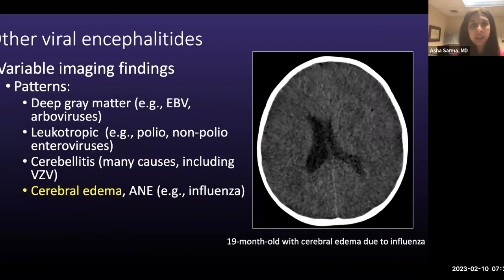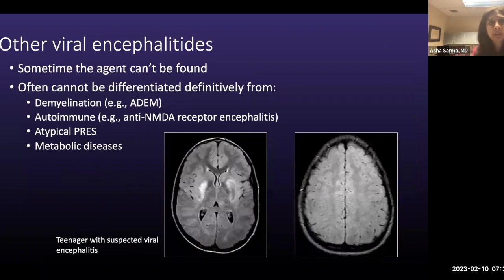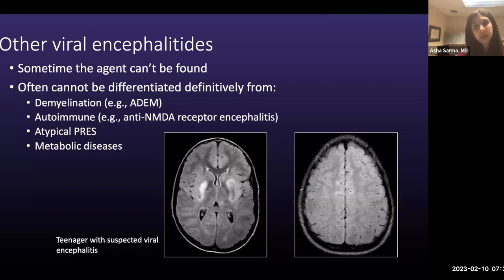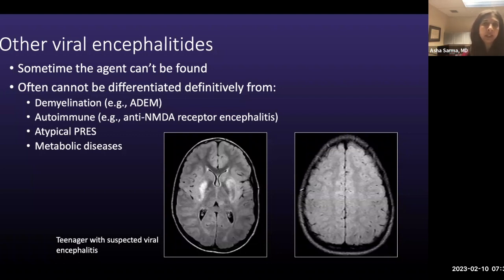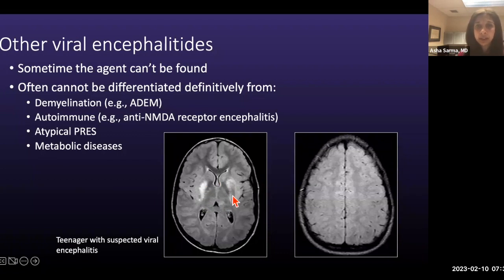You can also get diffuse cerebral edema from viral infections — here's an example from influenza. It's important to remember that sometimes the agent can't be found because imaging findings overlap with non-infectious entities. Differential diagnoses we've encountered include demyelinating conditions such as ADEM with bilateral fluffy scattered lesions involving deep gray and white matter, autoimmune encephalitis such as anti-NMDA receptor encephalitis, atypical PRES, or even metabolic diseases. Here's a troublesome case with bilateral basal ganglia lesions, thalamic involvement, and cortical involvement in both frontal lobes — no underlying cause was ever found.